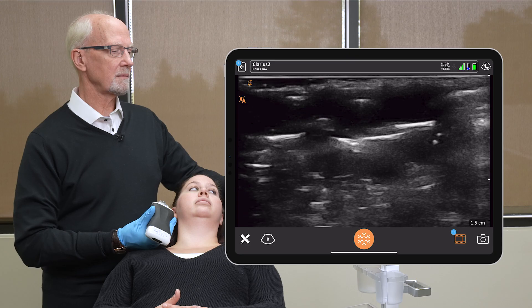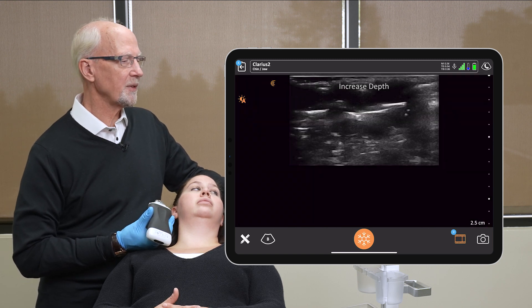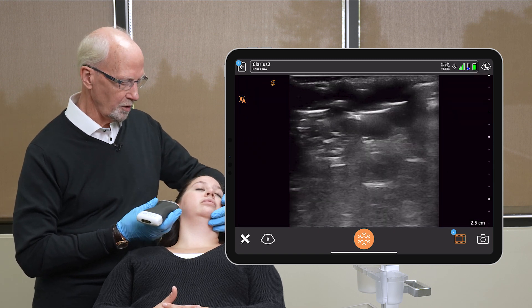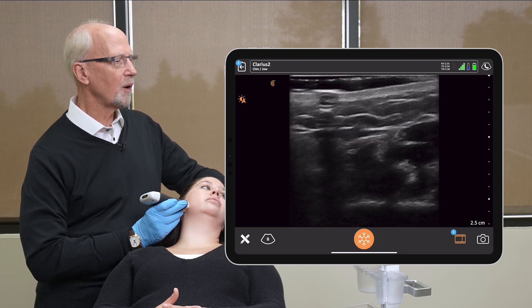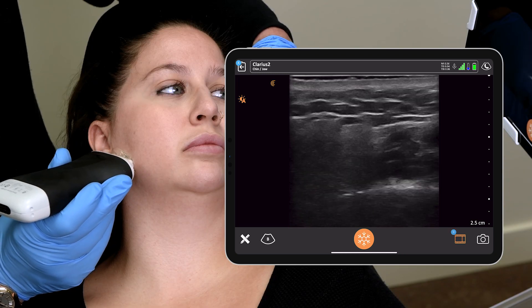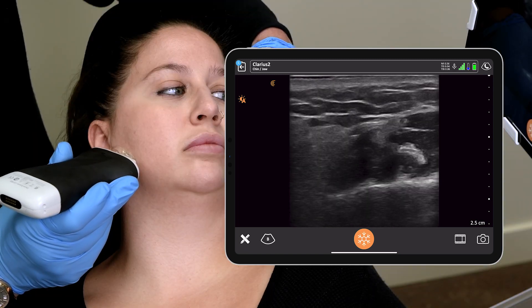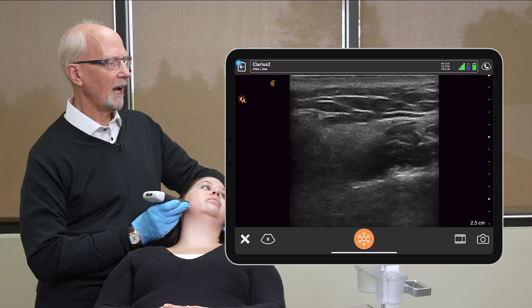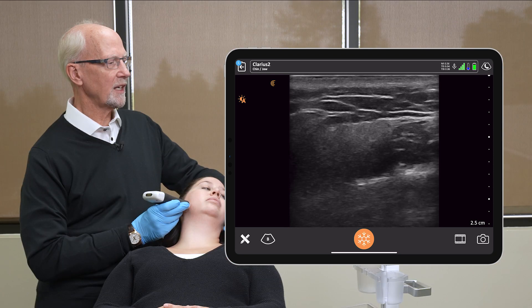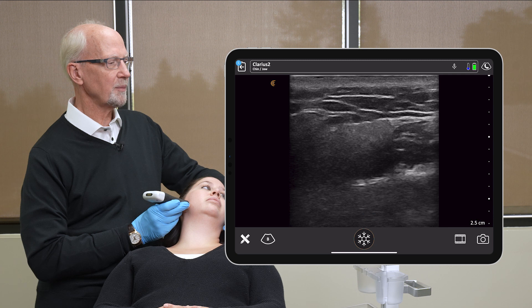We're at 1.5 centimeters — I'm going to increase depth to 2.5 centimeters for working on the posterior aspect of the jaw. What I'm looking for at the bottom is the mandible as a really clear white line. Freeze. In this image, you can see the mandible at the bottom.